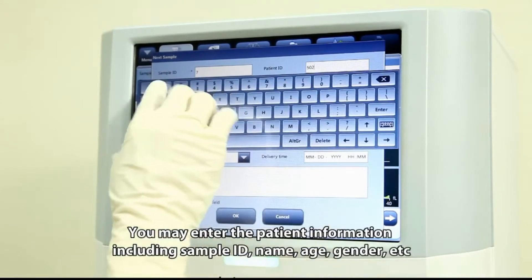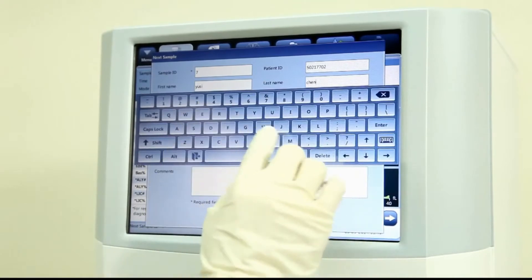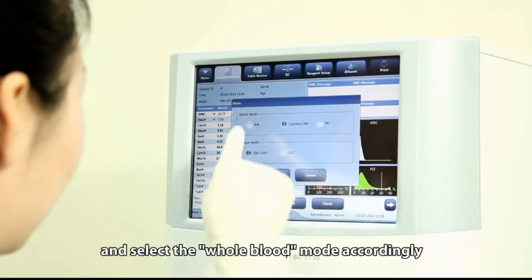You may enter the patient information including sample ID, name, age, gender, etc., and select the whole blood mode accordingly.